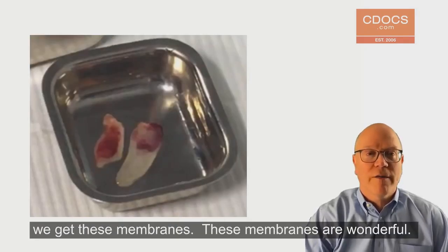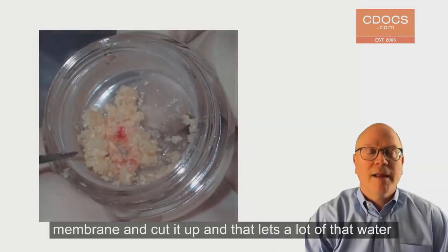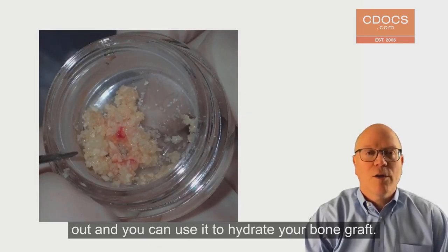We compress it and we get these membranes, and these membranes are wonderful. You can take a piece of membrane and cut it up — that lets a lot of the water out — and you can use it to hydrate your bone graft.